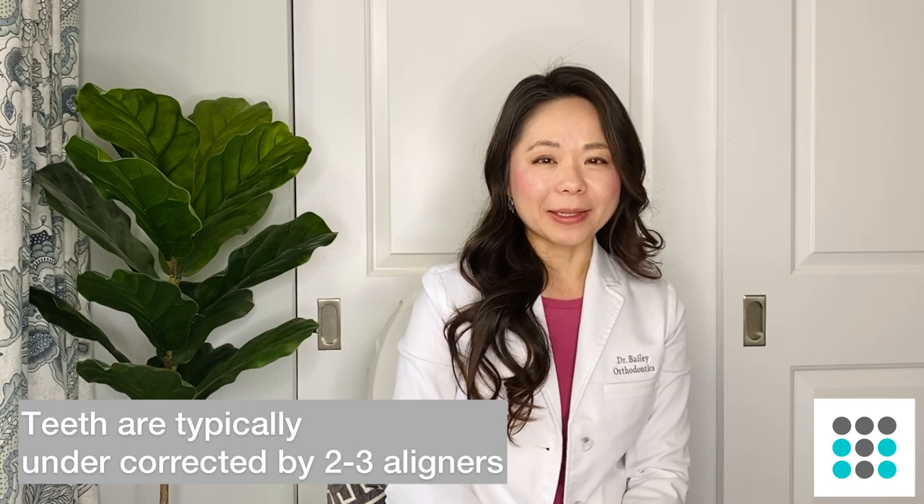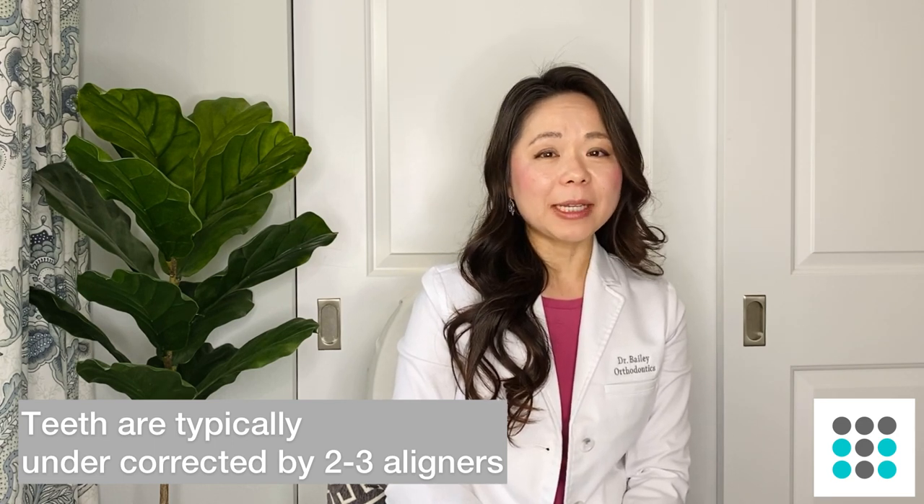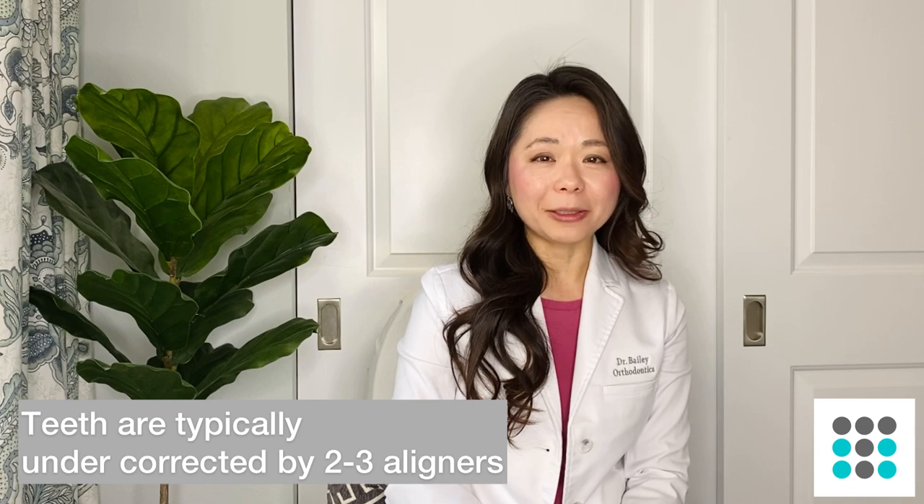The thing to remember is that your teeth actually do not 100% match the shape of your aligners. That's because there is some give to the aligners so your teeth do not fit into that form 100%. So in general, I will tell my patients that if you are on aligner number 20, your teeth actually look like they're on stage number 17 or 18. It just means that your teeth aren't 100% the same as what is predicted.